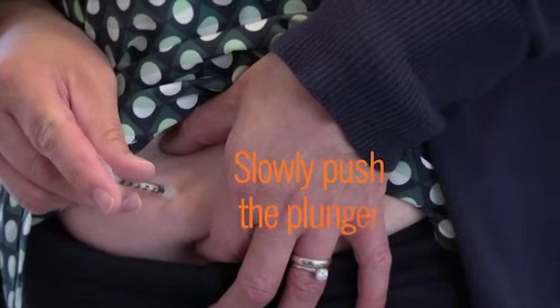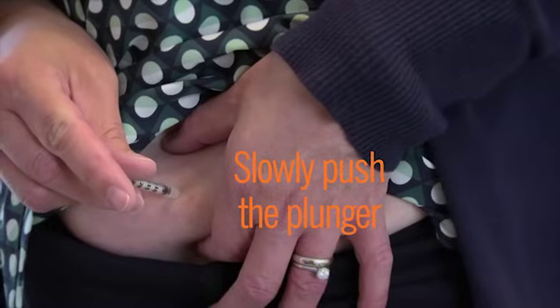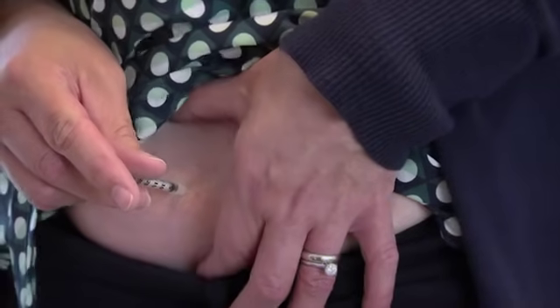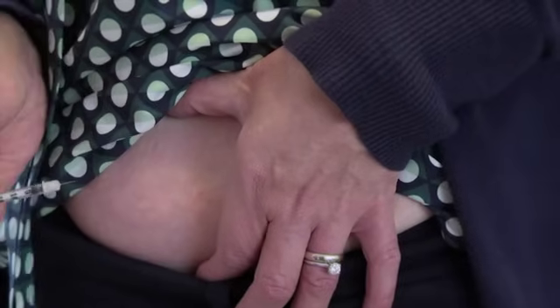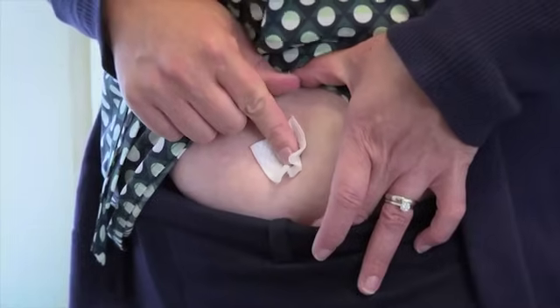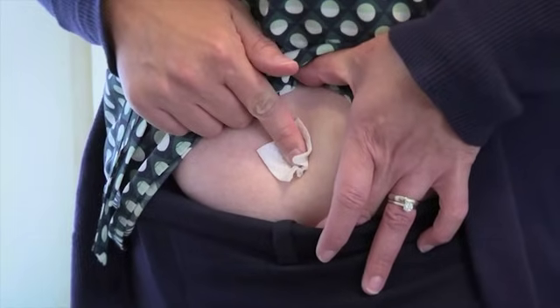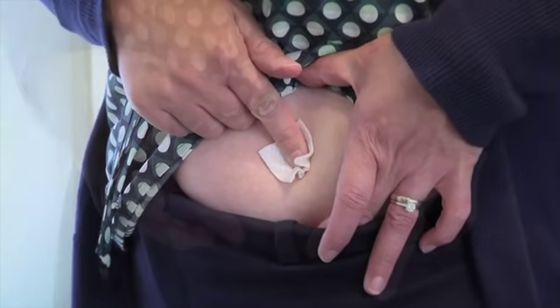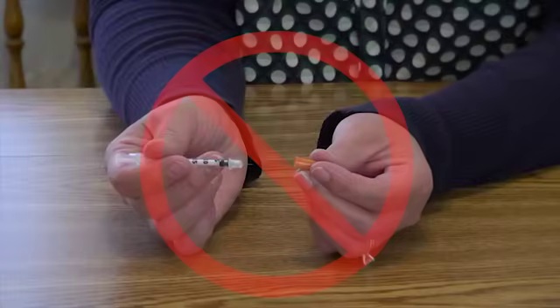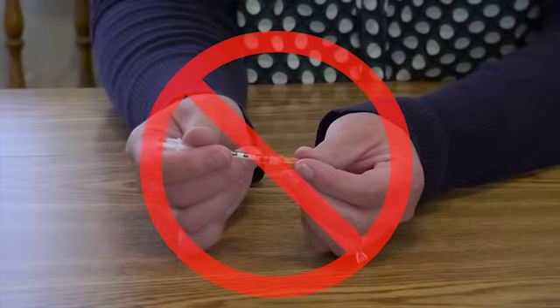Slowly push the plunger of the syringe until all of the insulin is pushed out. Stop pinching your skin and pull the needle out. You may bleed at the injection spot — if so, apply pressure with a clean alcohol wipe or a cotton ball, and cover the injection site with a bandage if necessary. Drop the entire syringe and needle into your container for used sharps equipment. Do not put the cap back on the needle.